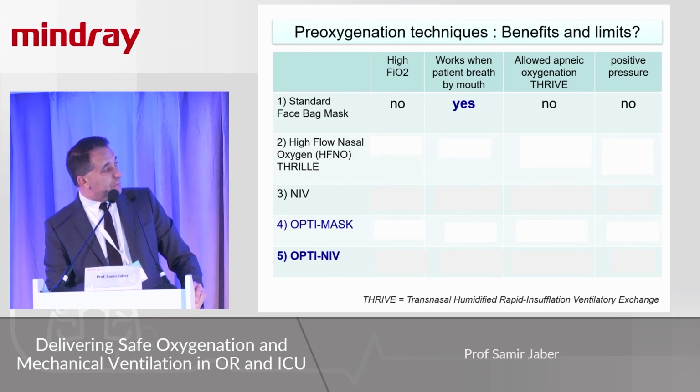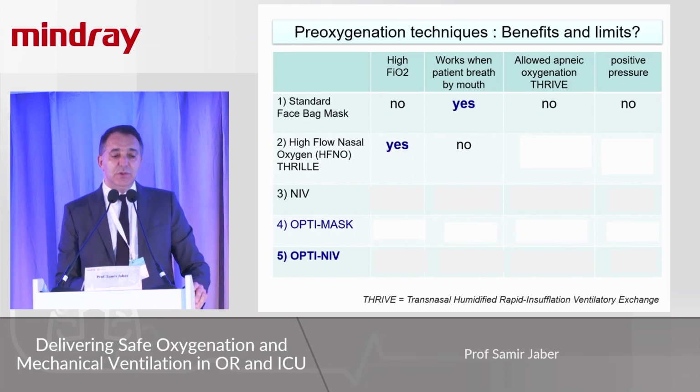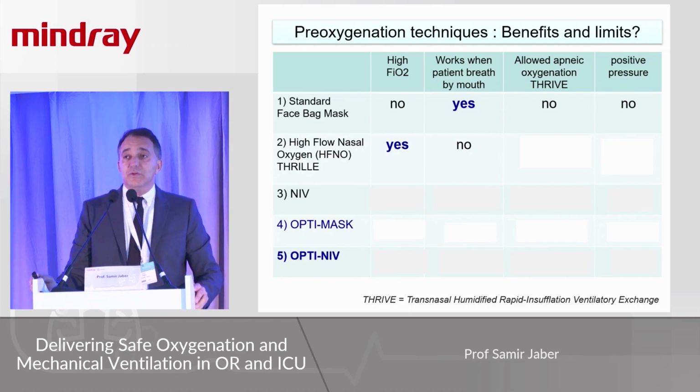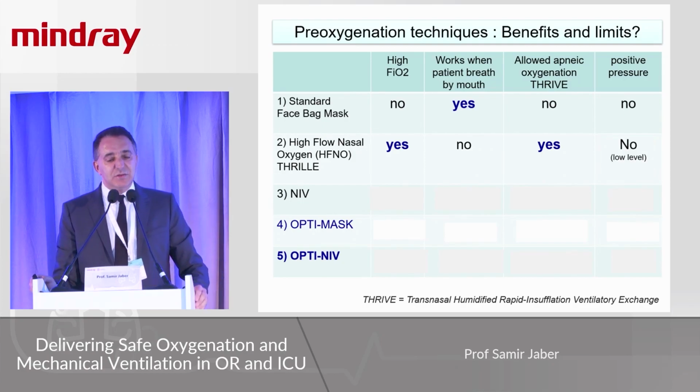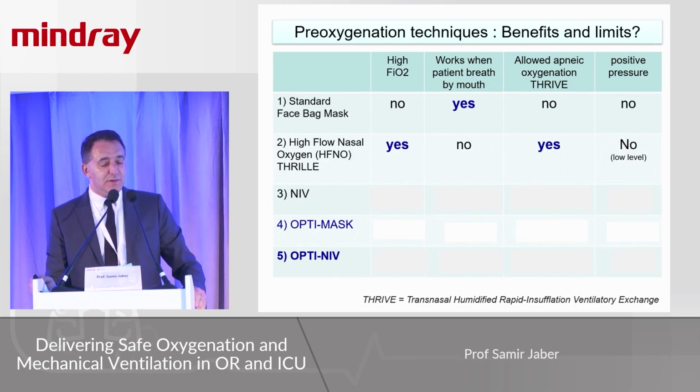It's not allowed apneic oxygenation and no positive ventilation. If you see what happened with high flow nasal oxygen cannula, it can deliver higher FiO2. It cannot work with mouth open, and we can have apneic oxygenation and not positive pressure, or a very little, very low level.